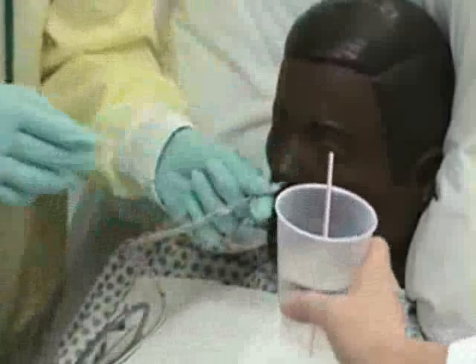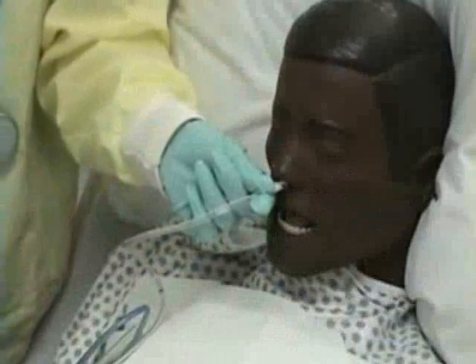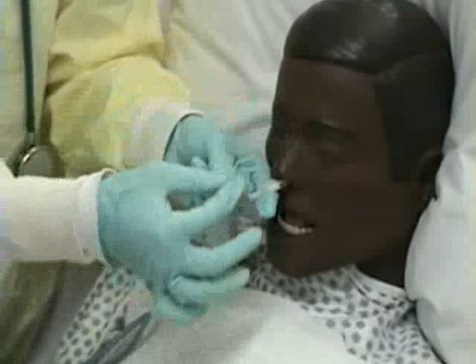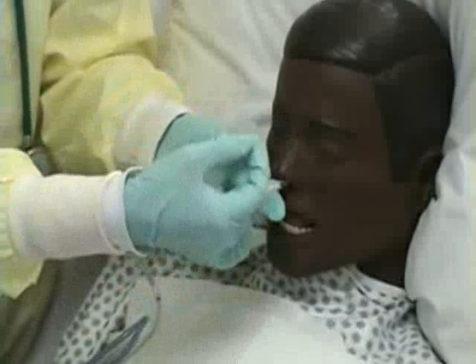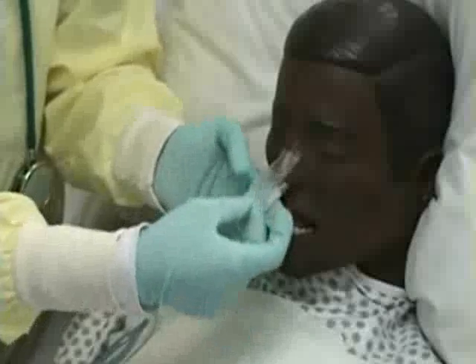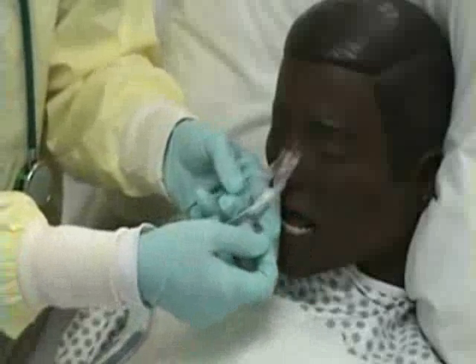I'm going to secure my tube with my tape that has the pants, by placing the waist of the pants on the nose and taking the pieces and wrapping around the NG tube.